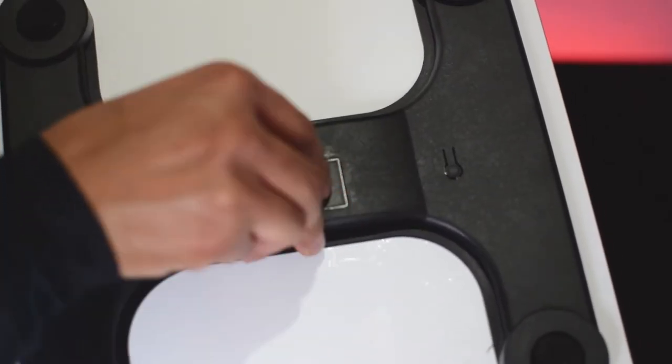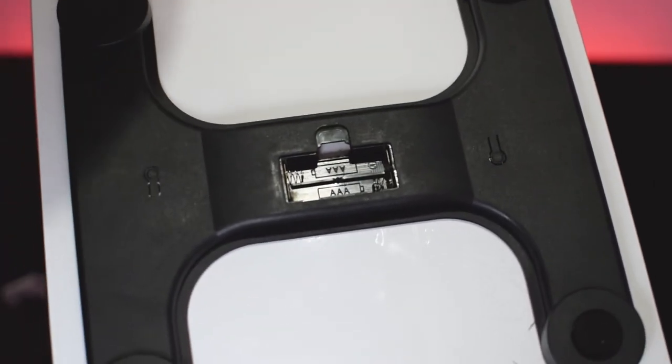Now, insert the batteries — open the battery compartment and insert the batteries.